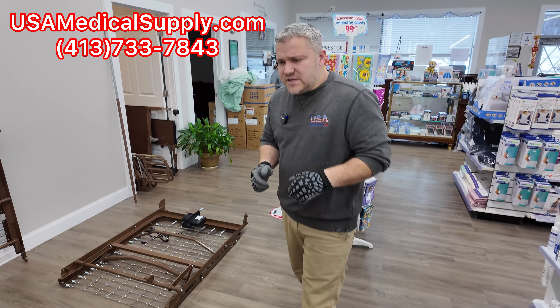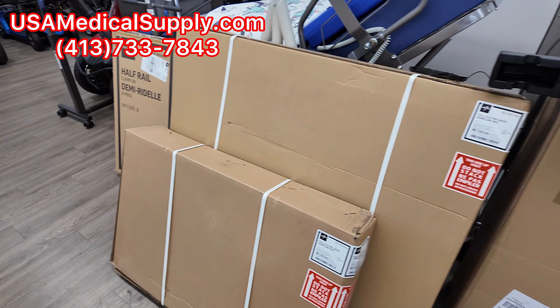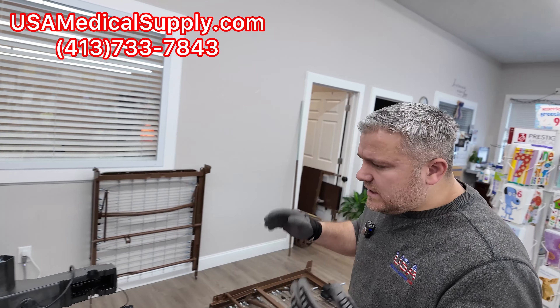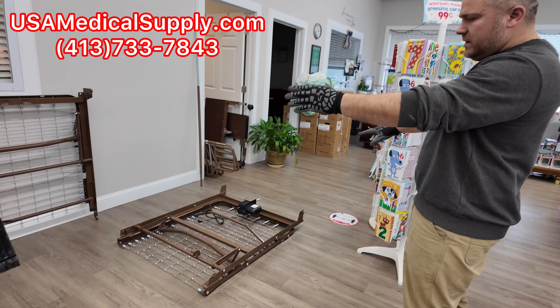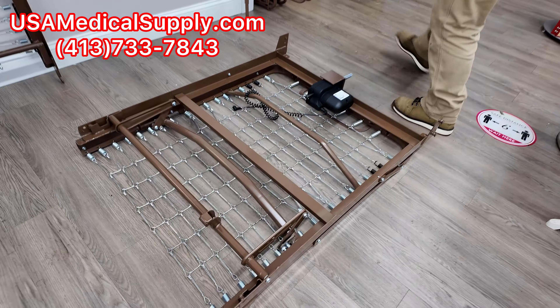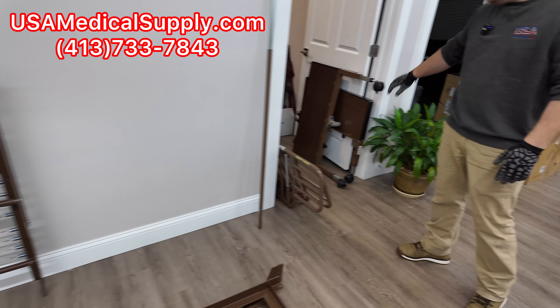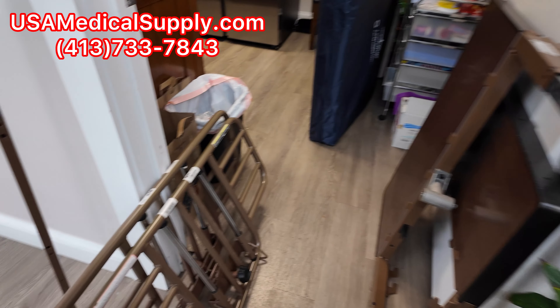To save some time we didn't show how you get things out of the box — we think that's pretty self-explanatory. There are going to be zip ties and cardboard you can recycle. Assuming you've taken everything out, I've separated them like this: the frame sections, the handrails, the footboard, the headboard, and the shaft.